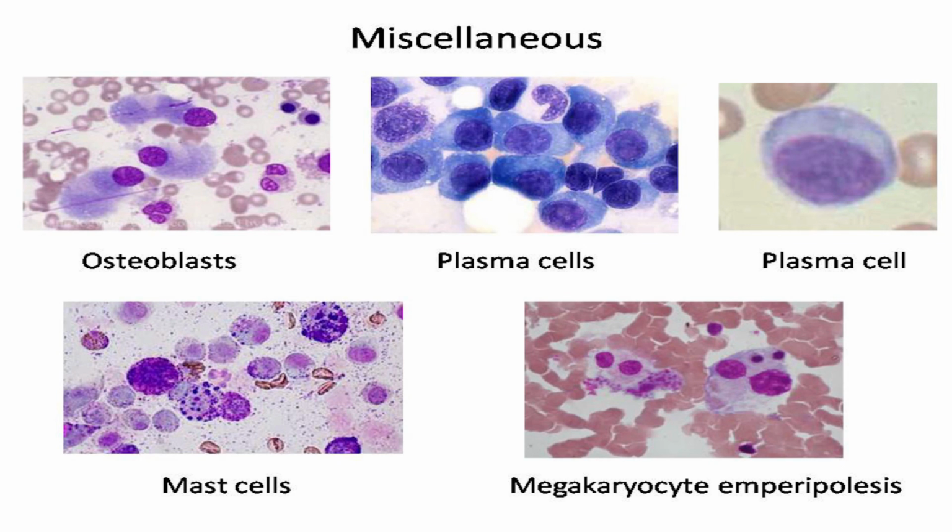Then plasma cells. Again, sometimes these plasma cells are a problem. Atypical plasma cells can give rise to problems in identification, but an overall increase in plasma cells, yes, you can count them in that. Otherwise, sometimes they are counted as blast cells also. Mast cells, and yes, emperipolesis is many times seen, mostly in infectious conditions.